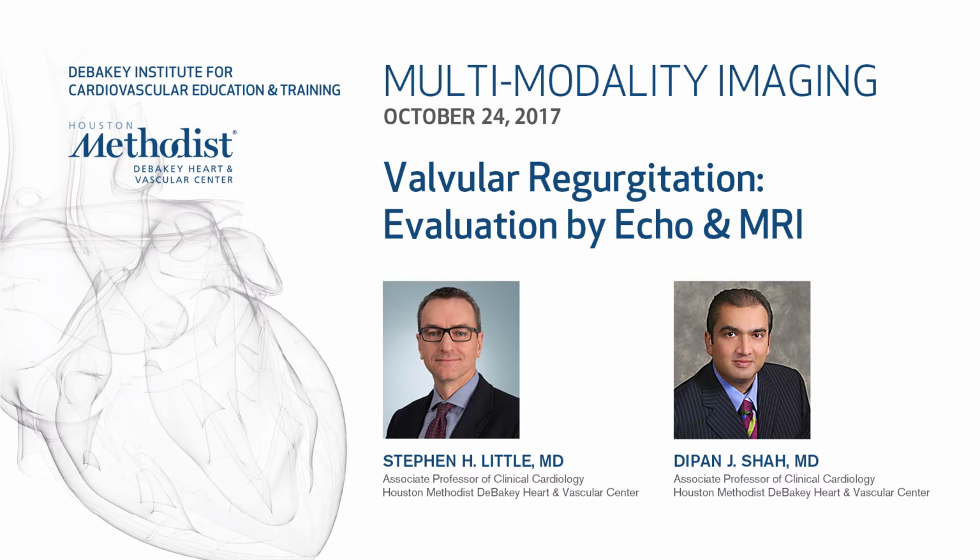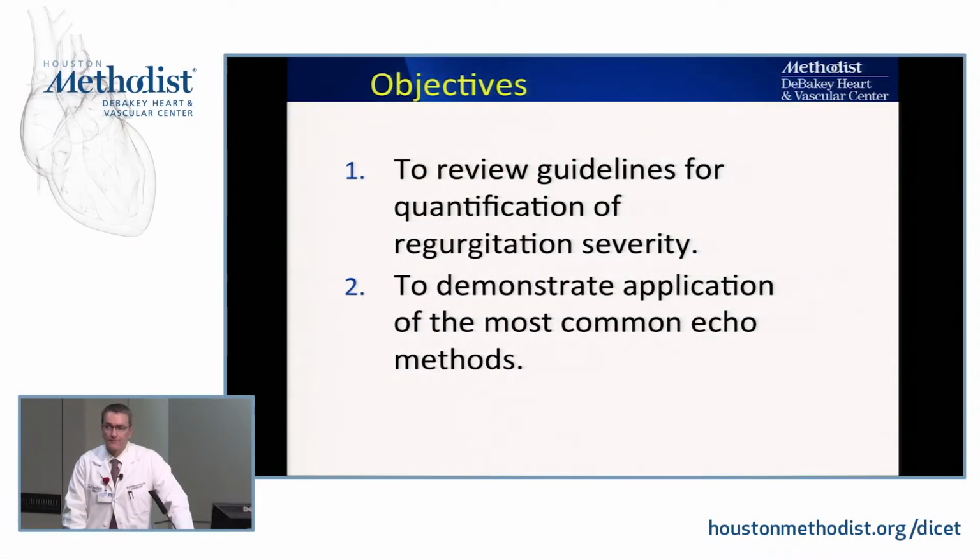I'll talk for the first half about echo and regurgitation, then Dr. Shah will come and talk about MRI. So let's talk about regurgitation. Briefly, we'll talk a little bit about guideline changes. You should all be familiar with that, but Dr. Shah, myself, and Dr. Zogby had a fairly large effort in the latest update of the guidelines that came out, so you'll see those, and demonstrate some applications.